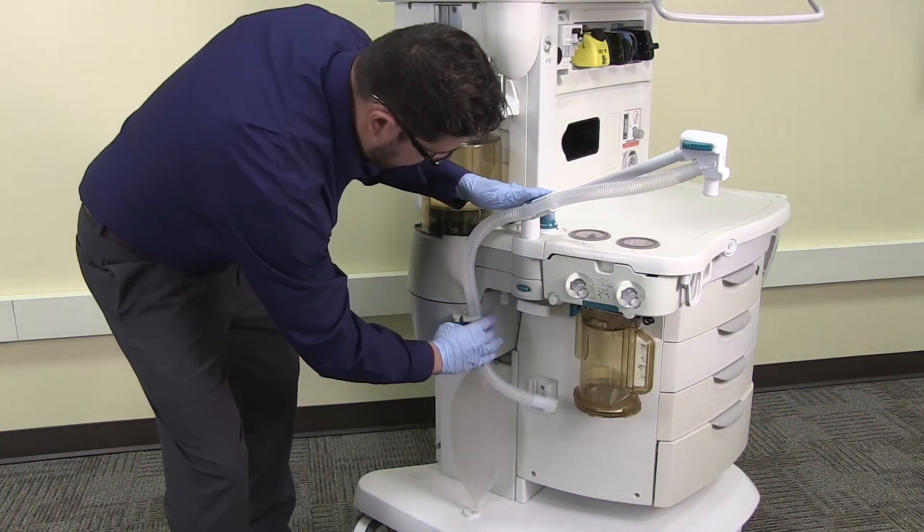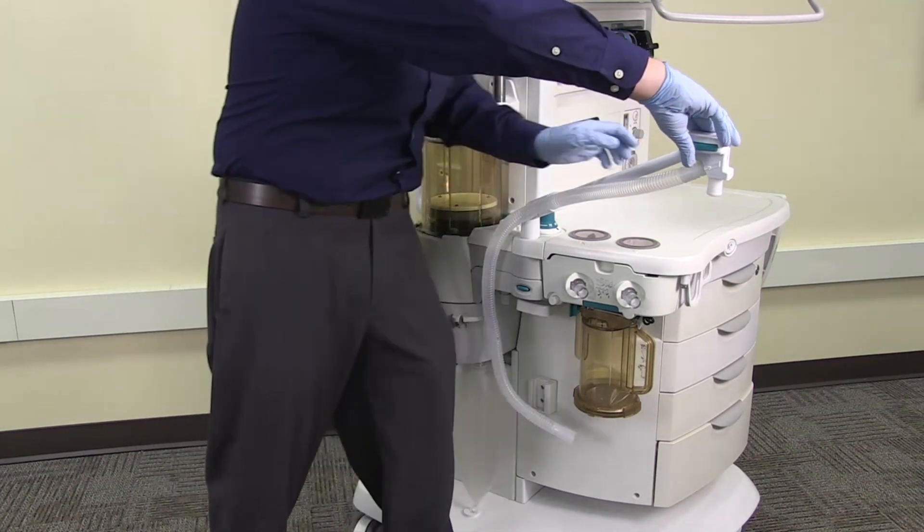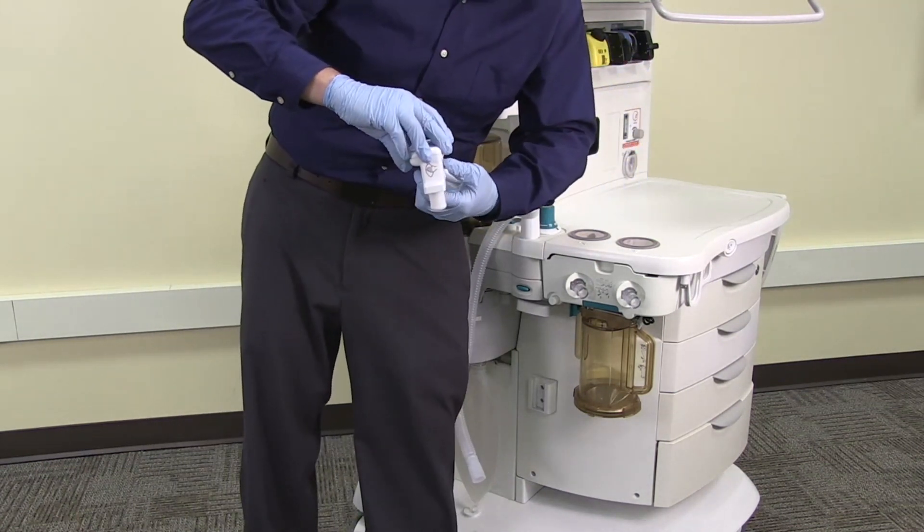Disconnect the bag hose from the bag hose connector and also from the clip. Remove the bag port elbow from the bag arm support.